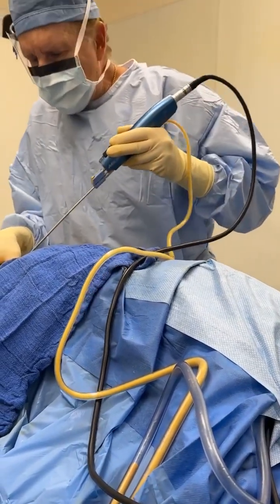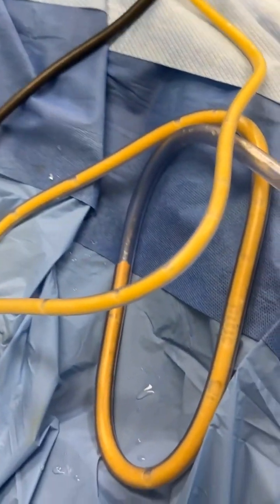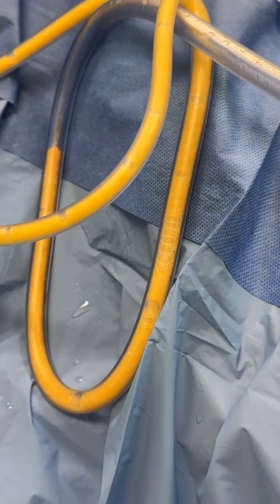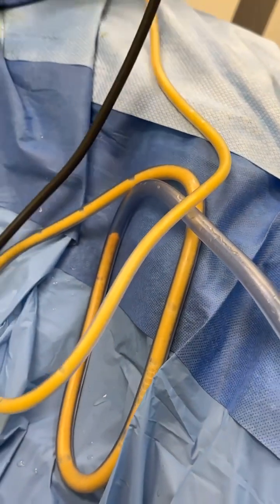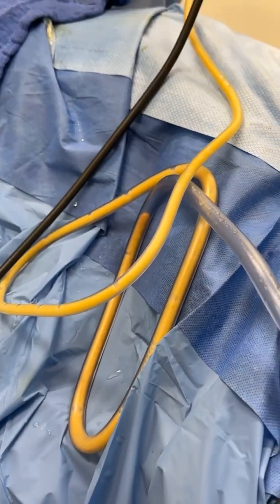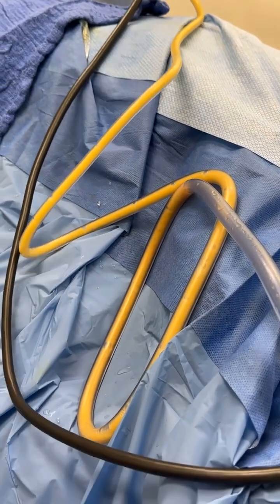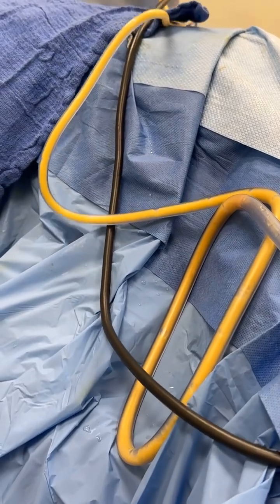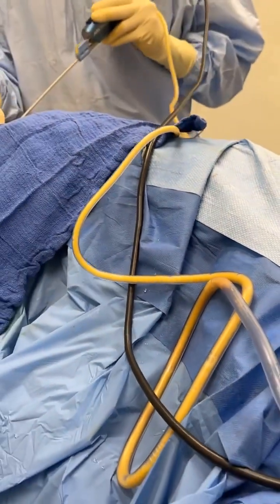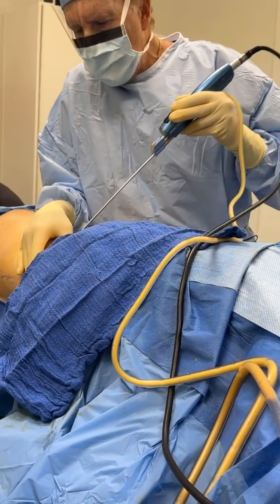And of course, the fat graft retention is going to be a lot higher, right? Because we're not putting fat and blood. We're putting just pure fat. And by the way, we don't have to purify this fat. So even though this takes me a while to do, our time is very efficient because we don't spend time purifying this fat because it's already pure. You see the difference, you guys? This is incredible.